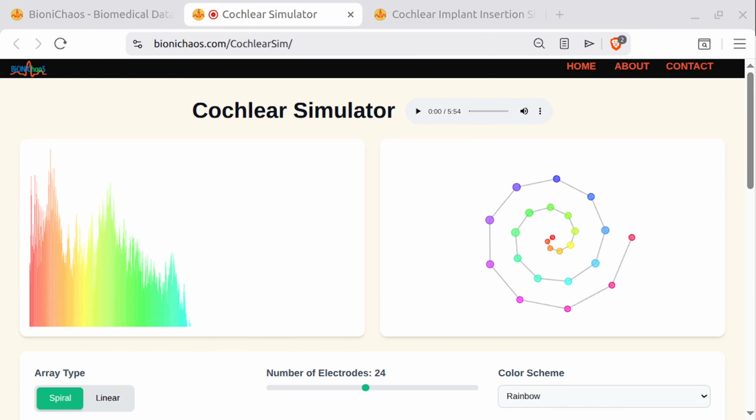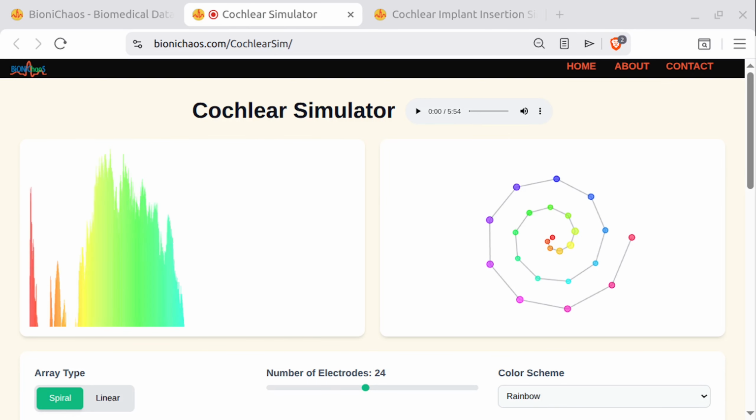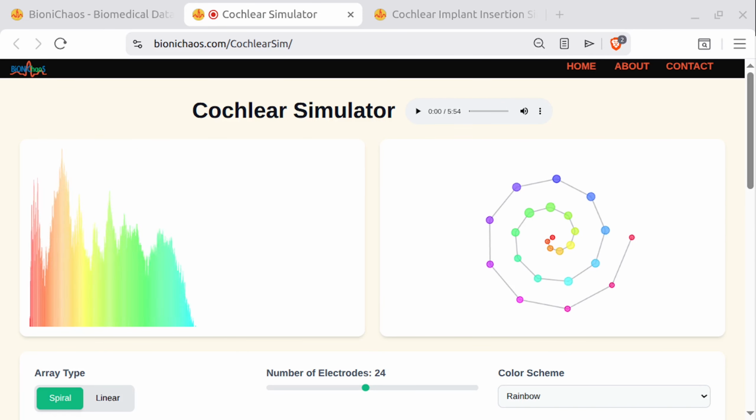When I look at cochlear implantation, I fully acknowledge the biological friction. Pushing a foreign body into the delicate fluid of the cochlea carries unavoidable risks of fibrosis, taste disturbance via the chorda tympani, and yes, severe vestibular impacts. It is a heavy toll. It requires rigorous preoperative protocols, heavy vaccination, and microscopic surgical precision.